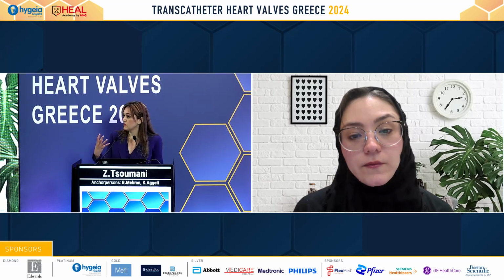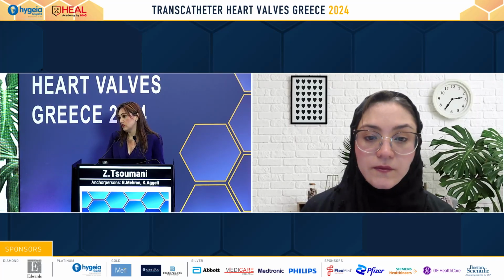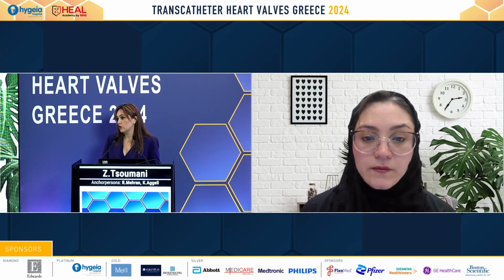Yes, it can help. Sometimes, you can see with cardiac CT, with functional imaging, how the lead interacts with the commissure or the leaflet, and see if it is stuck there or not. But sometimes we may have blooming artifacts because of that lead, and then maybe echo is a much better choice. So generally yes, but it has its own limitations. You cannot predict from the beginning.